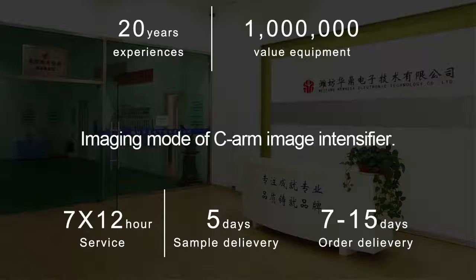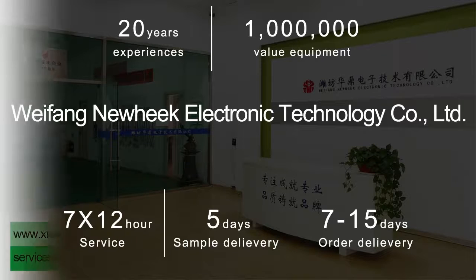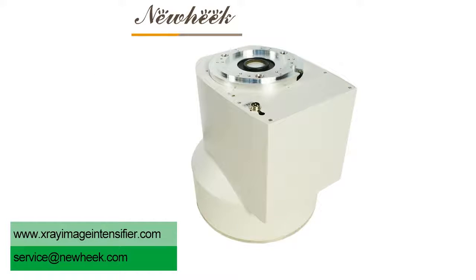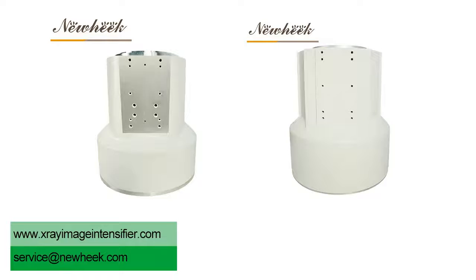C-arm image intensifier is an important part of C-arm. The X-ray emitted by X-ray source is first converted into visible light through the input conversion screen of image intensifier. The visible light irradiates the photocathode and emits electrons. After acceleration and focusing, the electron beam bombards the fluorescent output screen to produce visible image.